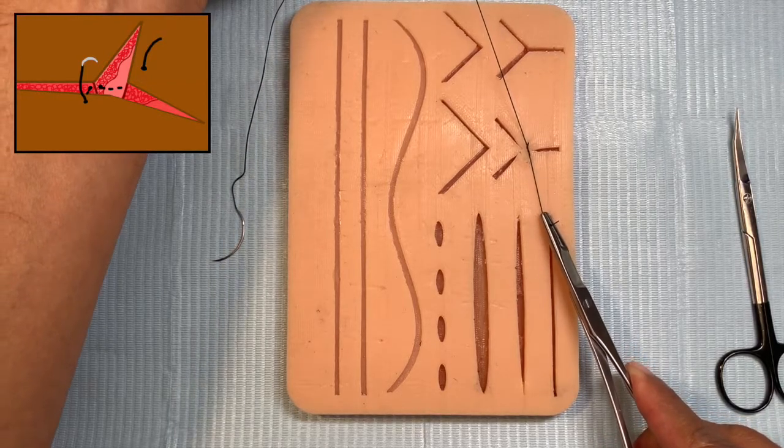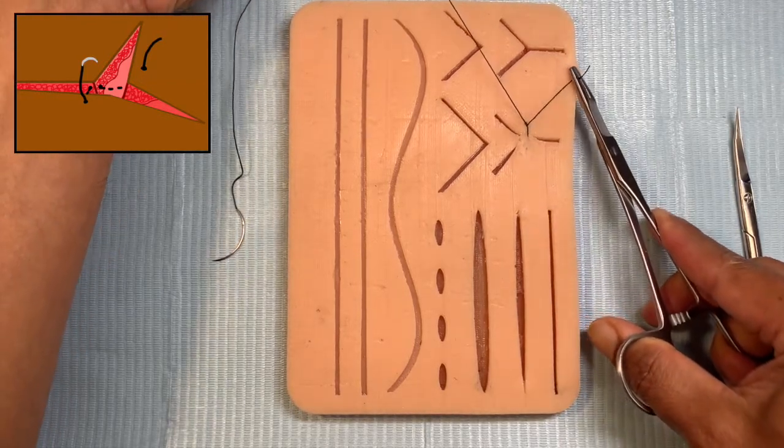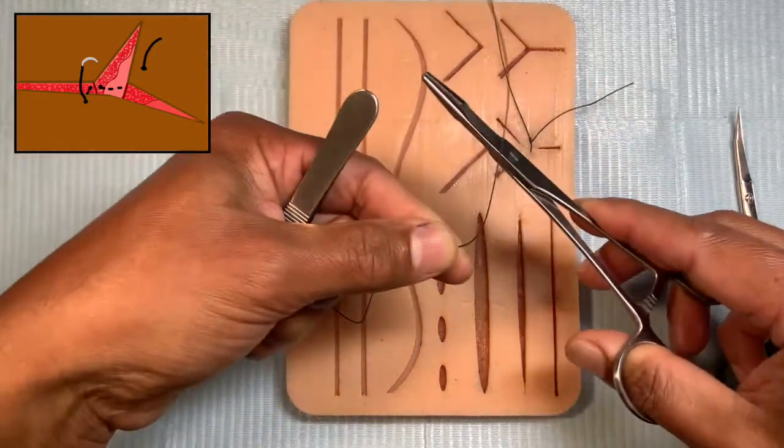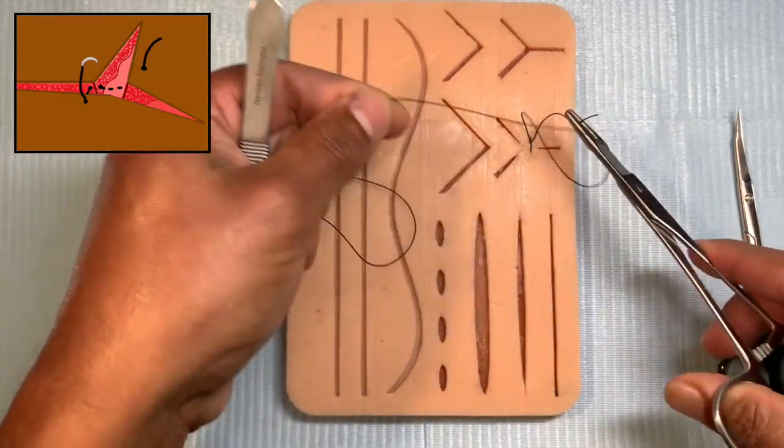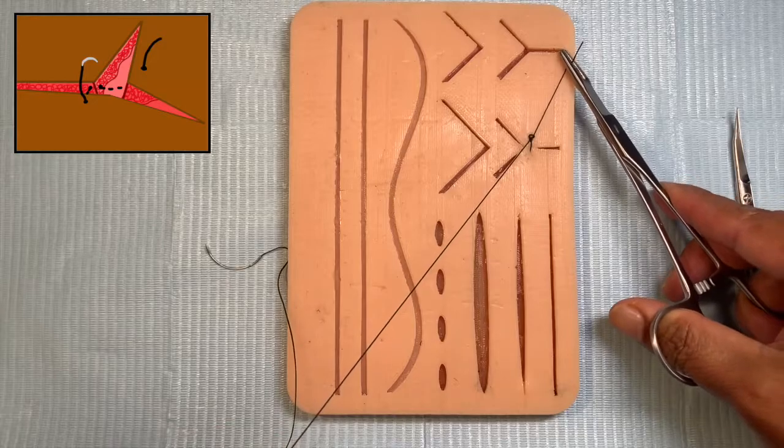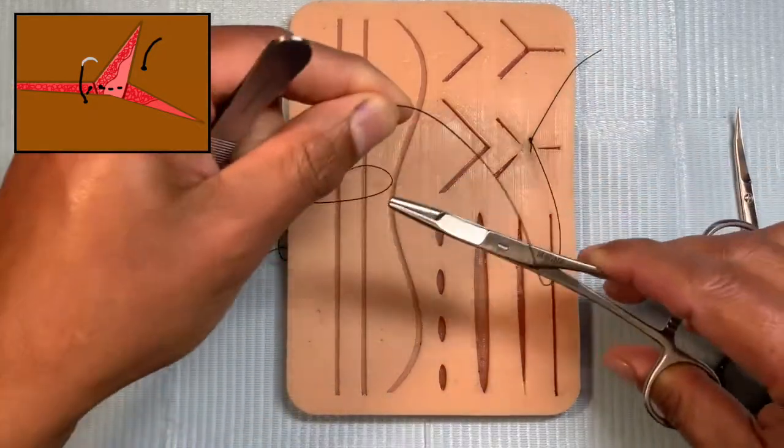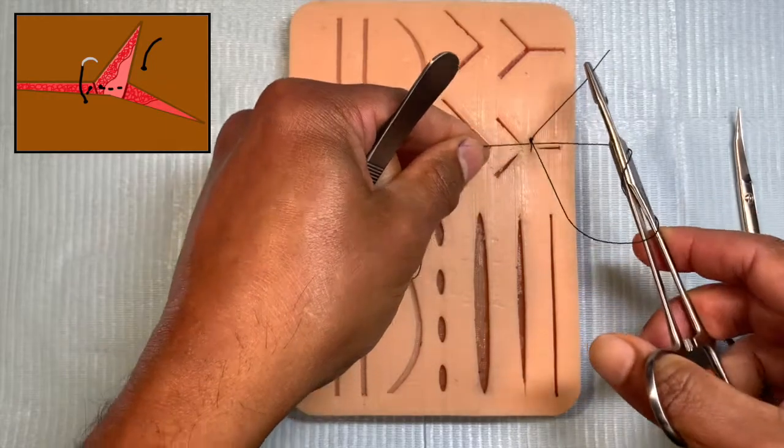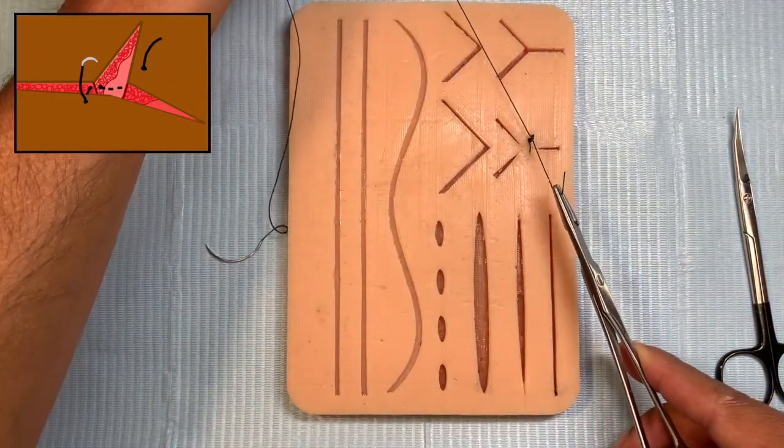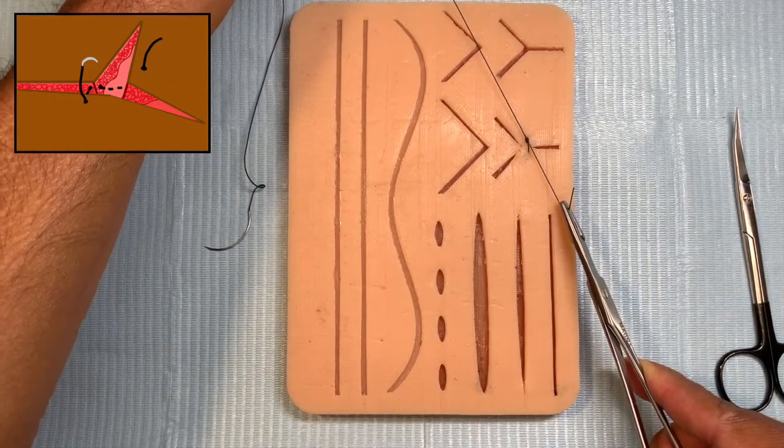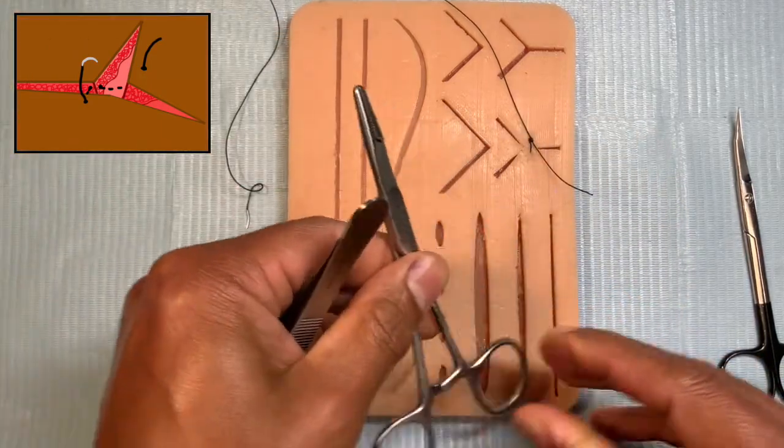You can see the edges coming together, this is the coarse adjustment and that's a fine adjustment to the side that locks everything in. Then you do one reverse—my hands are not crossing each other, it's basically moving backward and forward with this. And there you've got the suture completed, this is your three-point suture done.